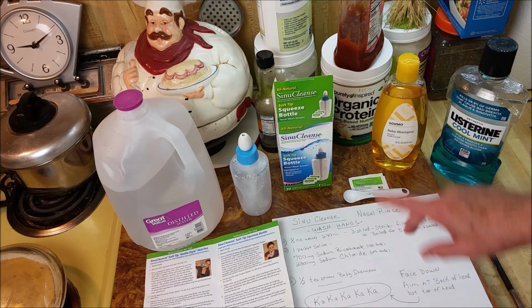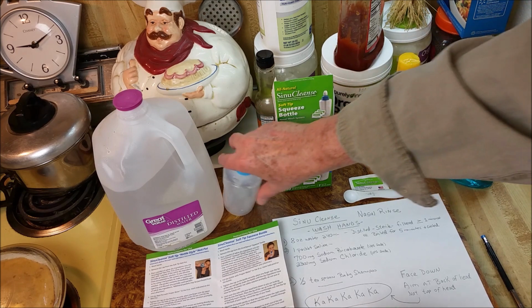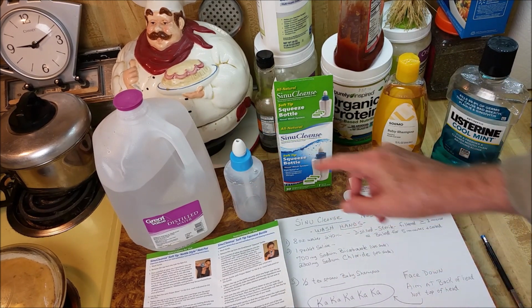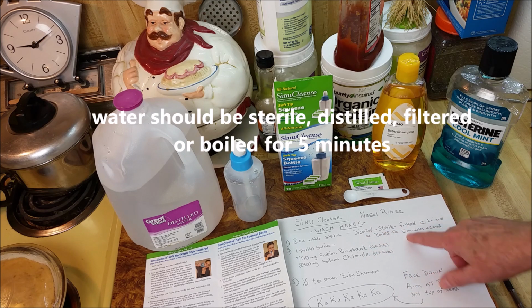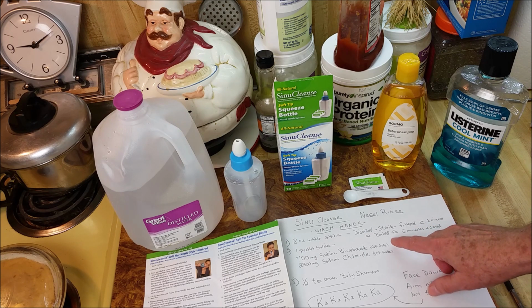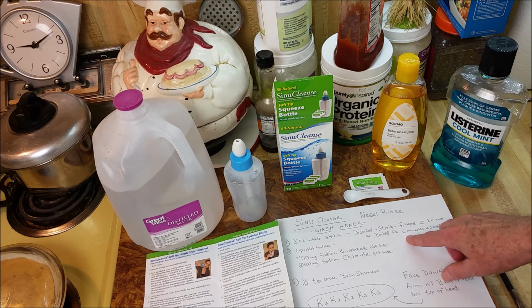This particular nasal rinse has a bottle that is used to squirt the water up your nose. You use 8 ounces of water. It has to be distilled, sterile, or filtered water, and the filtration has to be through less than 1 micron or equivalent to 1 micron. Or you can use water that's been boiled, like from your tap, for 5 minutes. This says 3 minutes depending on your elevation, but I just went ahead and did 5 minutes.